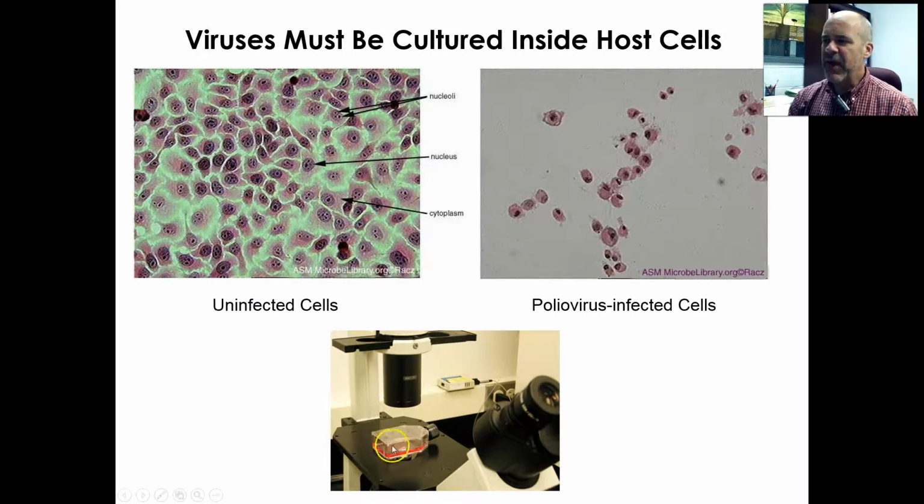And then you've got to be a very highly skilled laboratory worker to grow these types of cells. These cultures get contaminated really easily. You've got to have much more expensive specialized equipment to do this. So it's not quite as routine. You won't walk into a typical clinical microbiology laboratory in a medical setting and see a lot of virus culture going on.